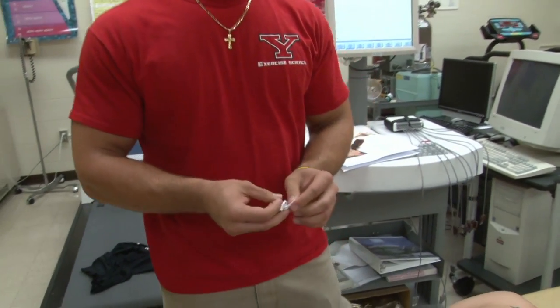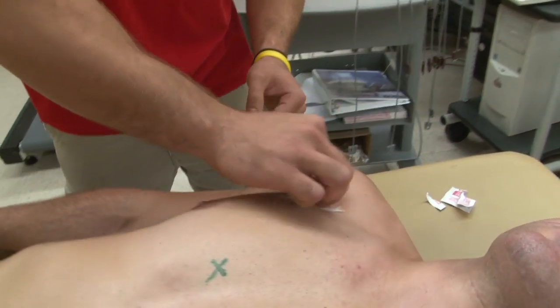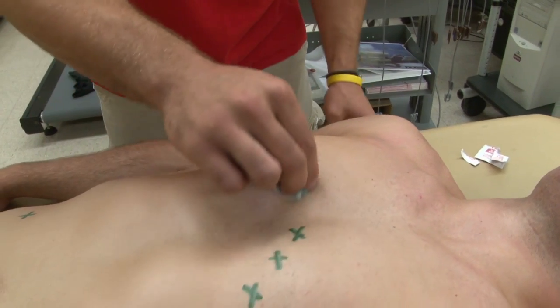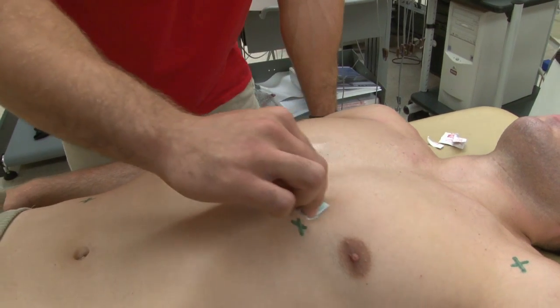Placement of these leads is critical for the ECG recordings to be correct, so don't just eye it up — palpate each anatomic position and place them in the correct spots. Now that each site is marked, we're going to begin the cleaning process. We're going to start by getting an alcohol wipe and rubbing down each site. The cleaning process is vital because if there's not good contact between the electrode and the skin, the electrode may fall off during the test, which is not what we want.